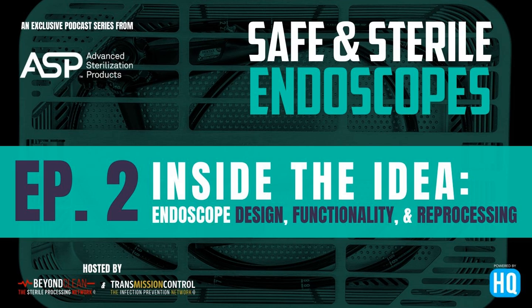Right. We know all the steps that we need to follow for manual cleaning. So taking those into mind and automating those steps, I think, is very important for us. It takes away the human error that's involved with manual cleaning. If someone forgets a certain step, forgets to do a leak check or something like that, or enough flow of high-level disinfectant through a channel, those are the kind of things that we're hoping to eliminate, the human error involved with manual reprocessing. And I think that's why AERs are such an important part of SPD.